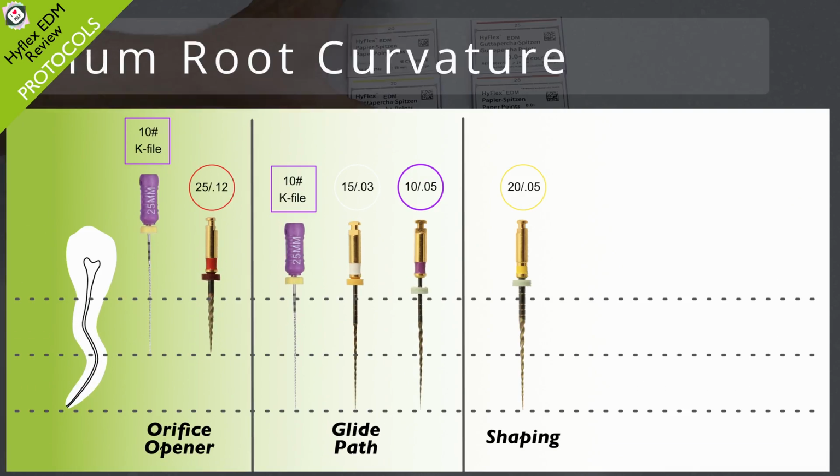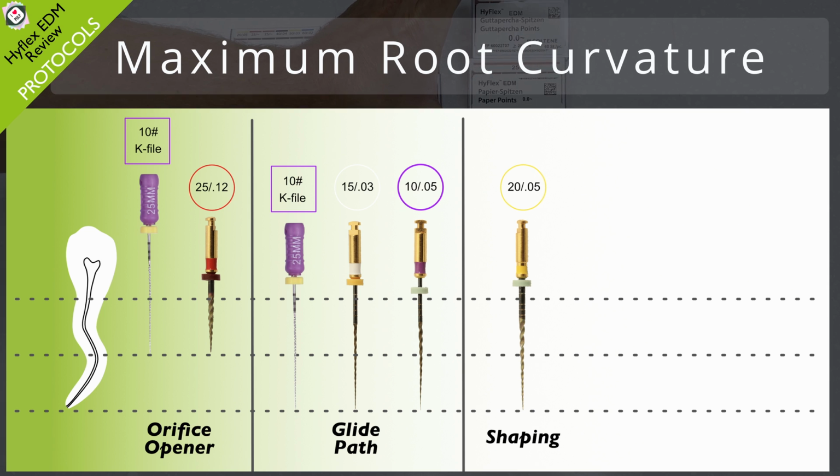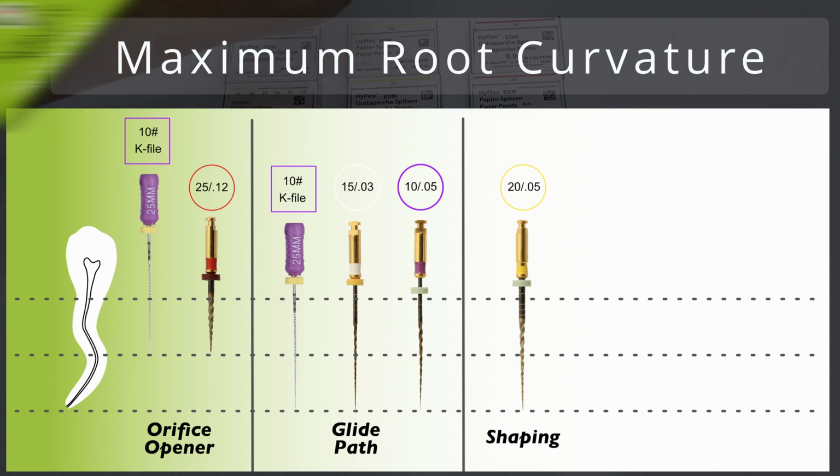Finally, the max curve shaping set is used for teeth that have severely curved anatomy. It has an interesting file progression from a size 15 Glidepath file that actually precedes the size 10 Glidepath file, which can be confusing, and an explanation is given for why this is so in the live demonstration later on in this video. Essentially though, it is due to the taper difference. This file system also suggests that the highest prep file to finish on is a size 20.